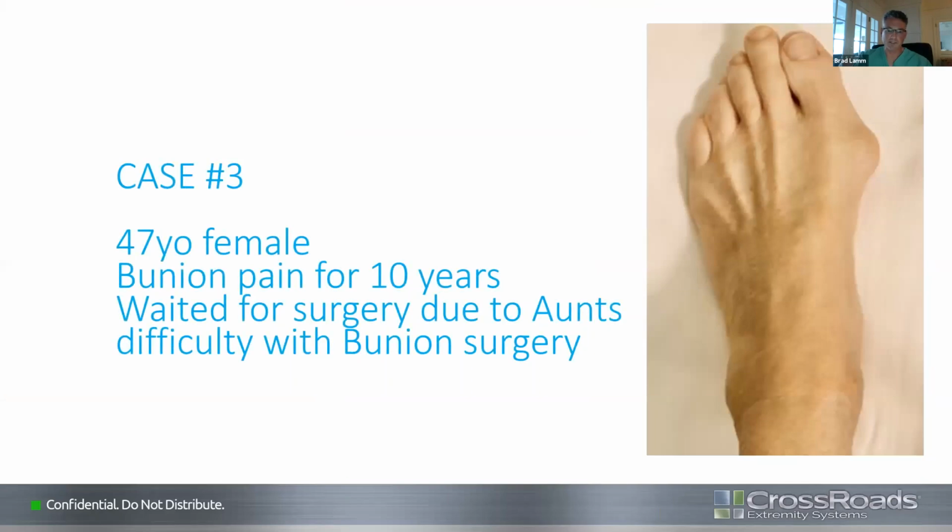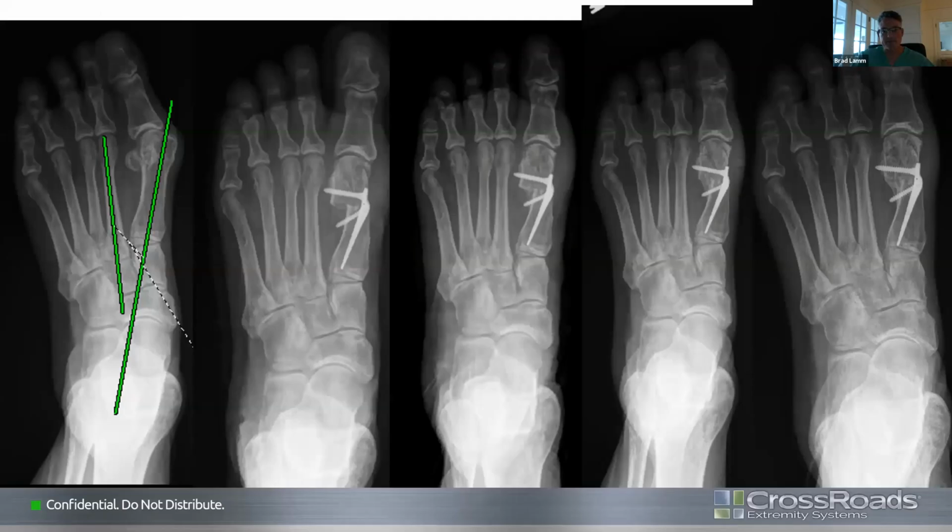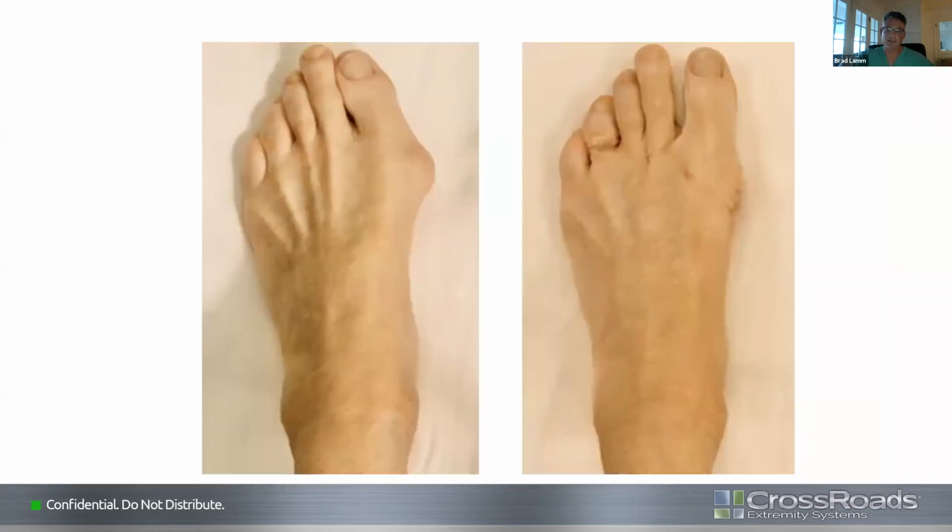Third case is a 47-year-old. And just to show you some intra-op pictures of putting the wire at the neck, the guide, inserting the implant, locking it proximal and distal, ensuring on the lateral you have your position. And here's the same kind of thing, showing the rotation, reduction of the sesamoid position, insertion of the implant and good healing of this patient. Here's just a before and after of her.